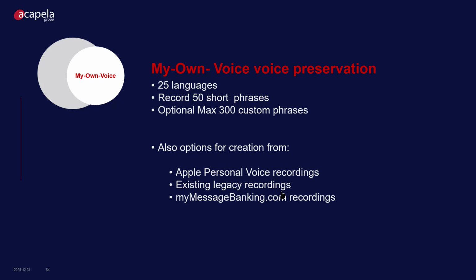And this is handy maybe if somebody was using their Apple personal voice but their voice started to fail and they weren't maybe so happy with the quality of the Apple personal voice. Those recordings can be used to generate an Acapela My Own Voice.